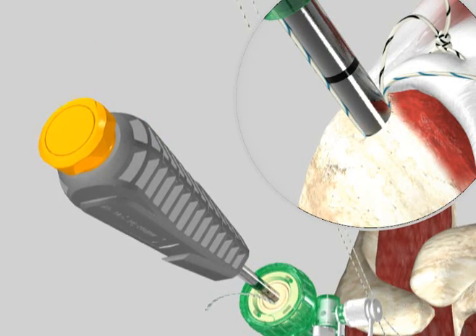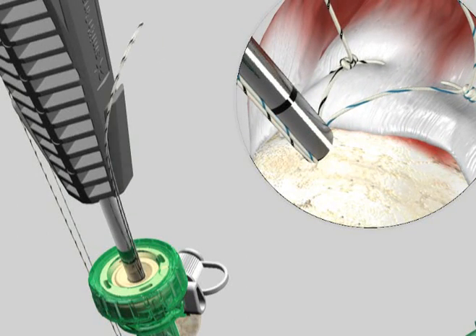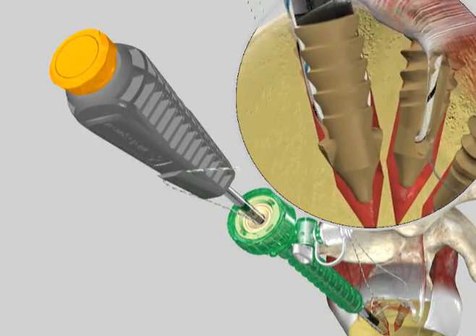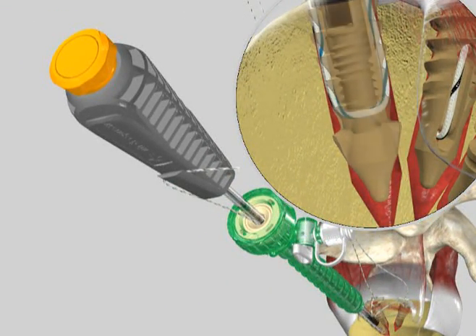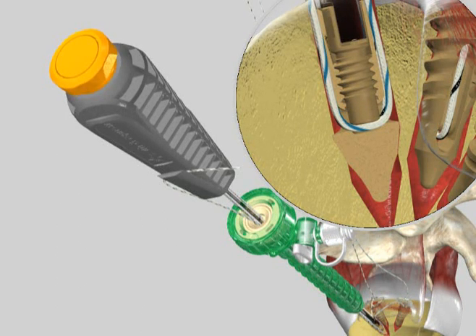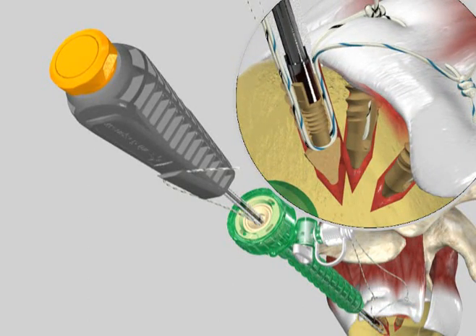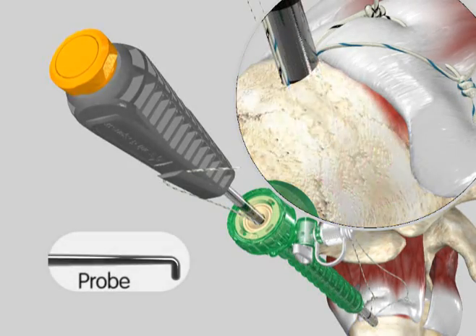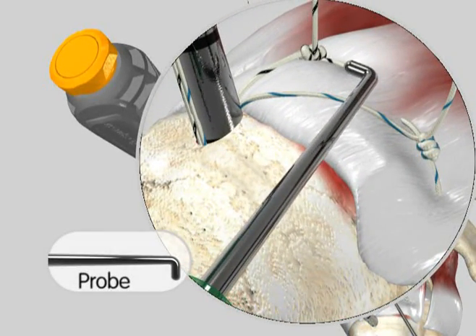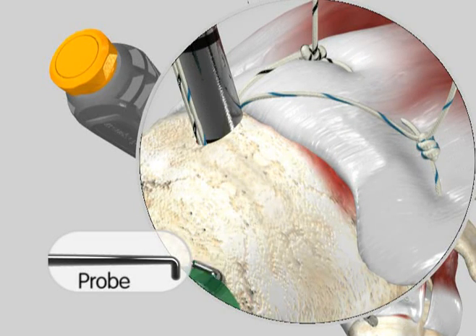While holding the inserter handle, pull on the free medial limbs until the desired amount of suture tension is set across the rotator cuff tissue. The suture limbs can then be secured within the tabs on the inserter handle. Once secured, rotate the torque limiter knob in a clockwise direction until several audible clicks are heard and the knob no longer advances the inner anchor plug. Check the final fixation. If satisfied, remove the inserter handle and cut the suture to finish.